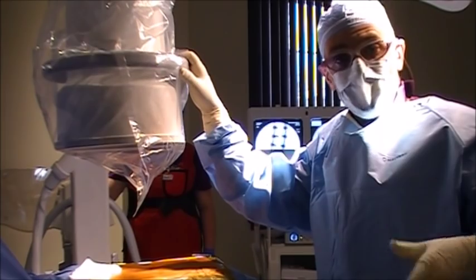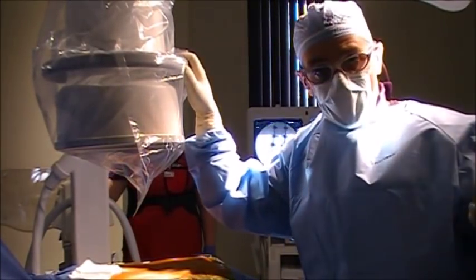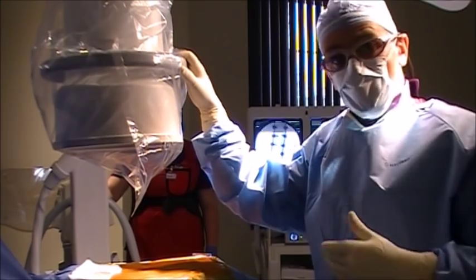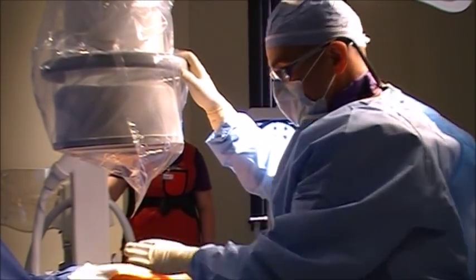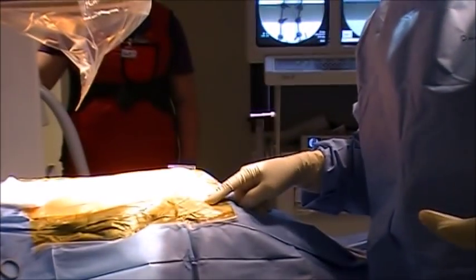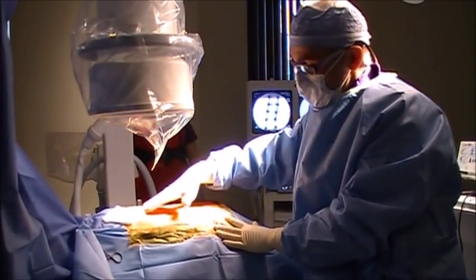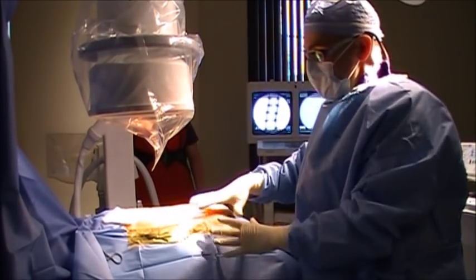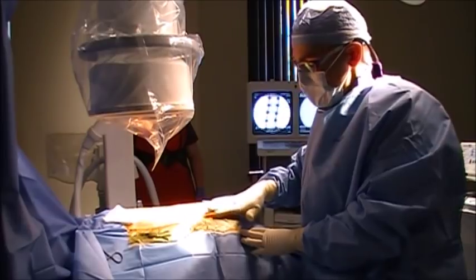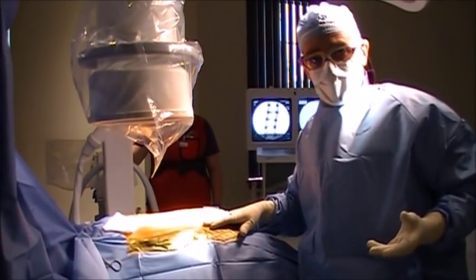We have shown the trial procedure on a prior video. The main difference today is that once the wire or percutaneous lead is locked in the correct spot and the patient is happy with where she feels the paresthesia, we will put a battery in. We have folks from Medtronic here as well. The battery is going to be about the size of an Oreo cookie — it looks like a pacemaker, essentially manufactured by the same company. We'll connect this battery to the wire underneath the skin, and she'll be able to control the stimulation by putting a magnet over her left buttock area to turn it on, off, and change settings.